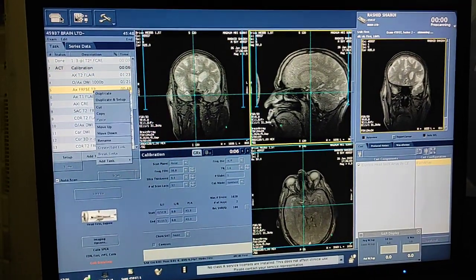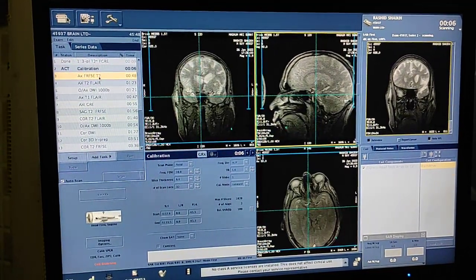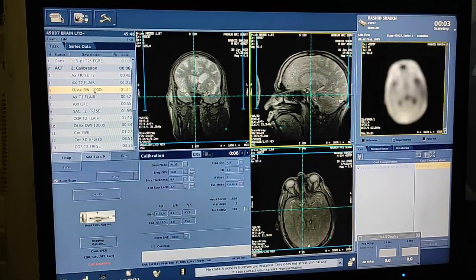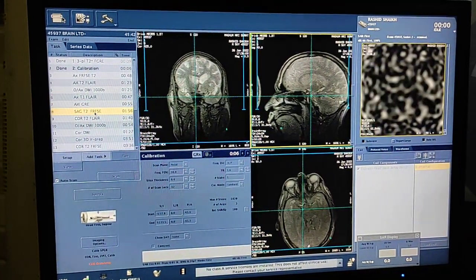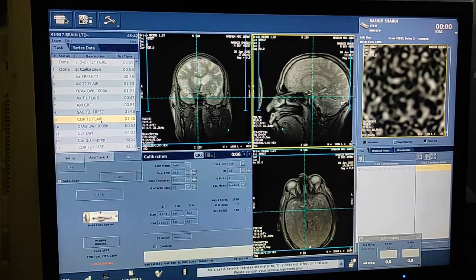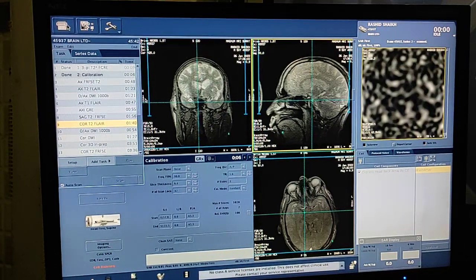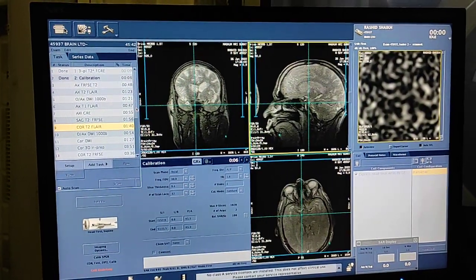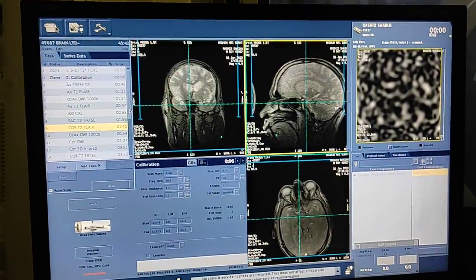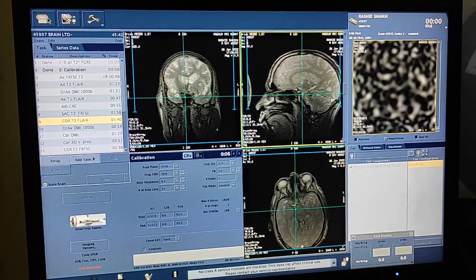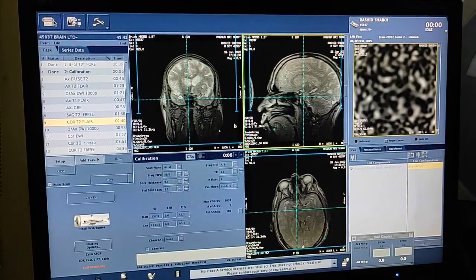First I will show you the protocol — what sequences you have to take in a routine brain scan. The protocol is: axial T2, axial FLAIR, axial DWI, axial T1, axial gradient, sagittal T2 for corpus callosum, and coronal FLAIR. If you need any other sequence, you have to ask your consultant radiologist. This is the standard protocol for routine brain scan.